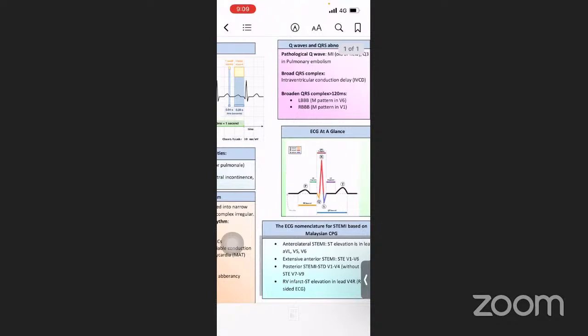And then you have irregular rhythms, like AF. But for AF, I group them under the first step, which is rate, followed by regular or not regular. Then the third step is whether it originates from the SA node. Like atrial fibrillation, the P wave is like the atrium is fibrillating. They don't contract in a very synchronized manner. So that one is atrial fibrillation.